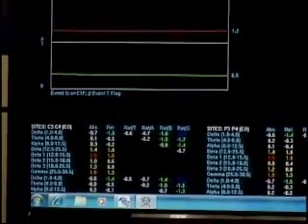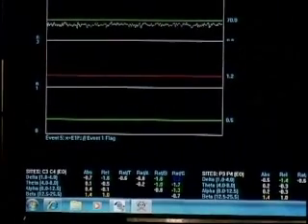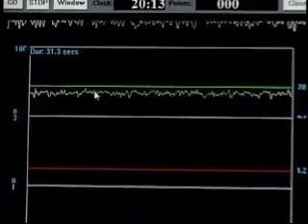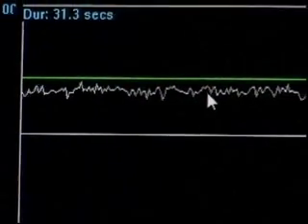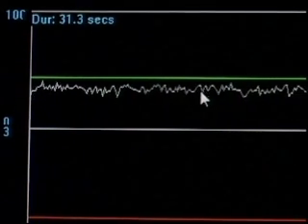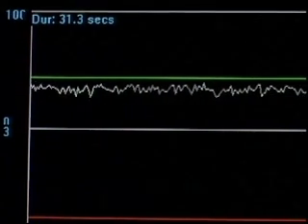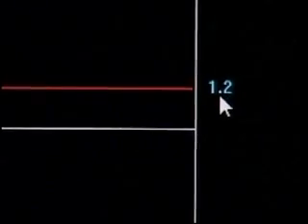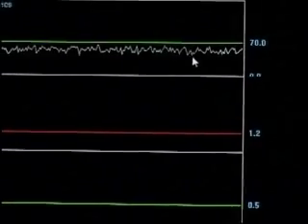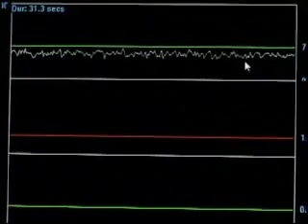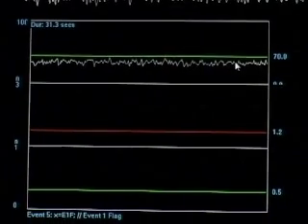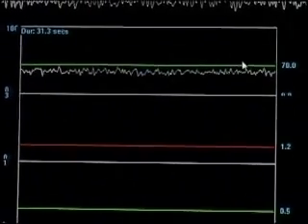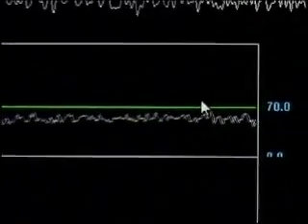As a quick summary on how z-score training works: the first squiggly white line represents the number of z-scores fitting within the bullseye that we chose — we currently chose plus or minus 1.2. These are the z-scores that fall within that parameter. The goal here would be to get these z-scores above 70% — as we get above 70% of the total z-scores being measured, we would get feedback.